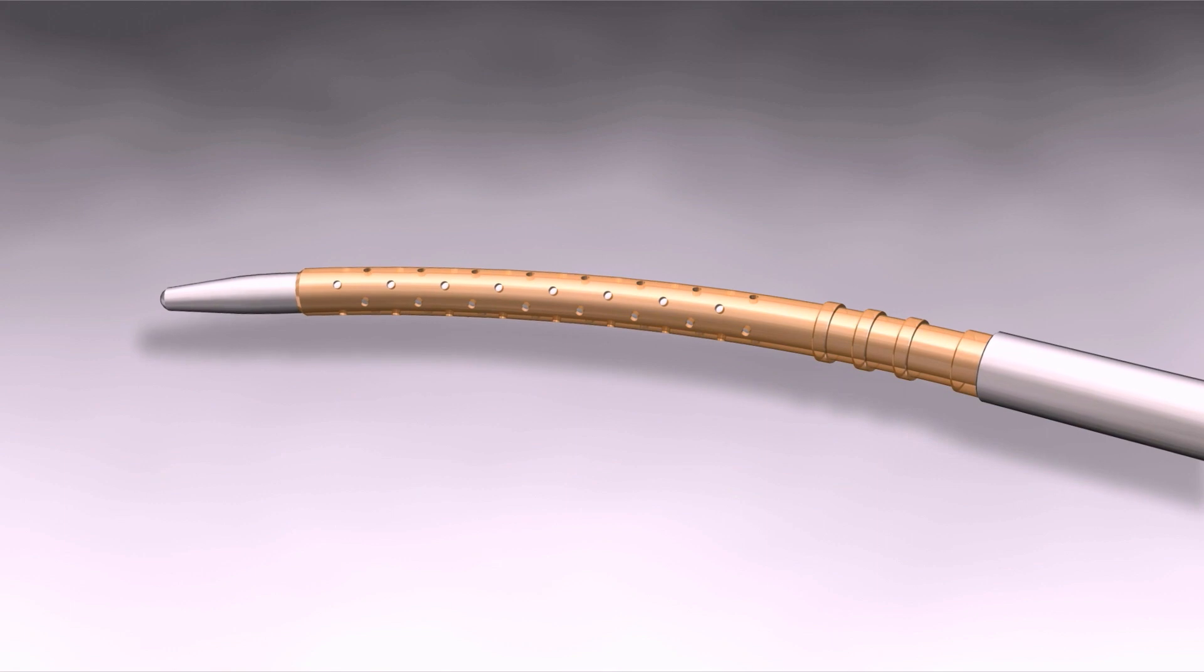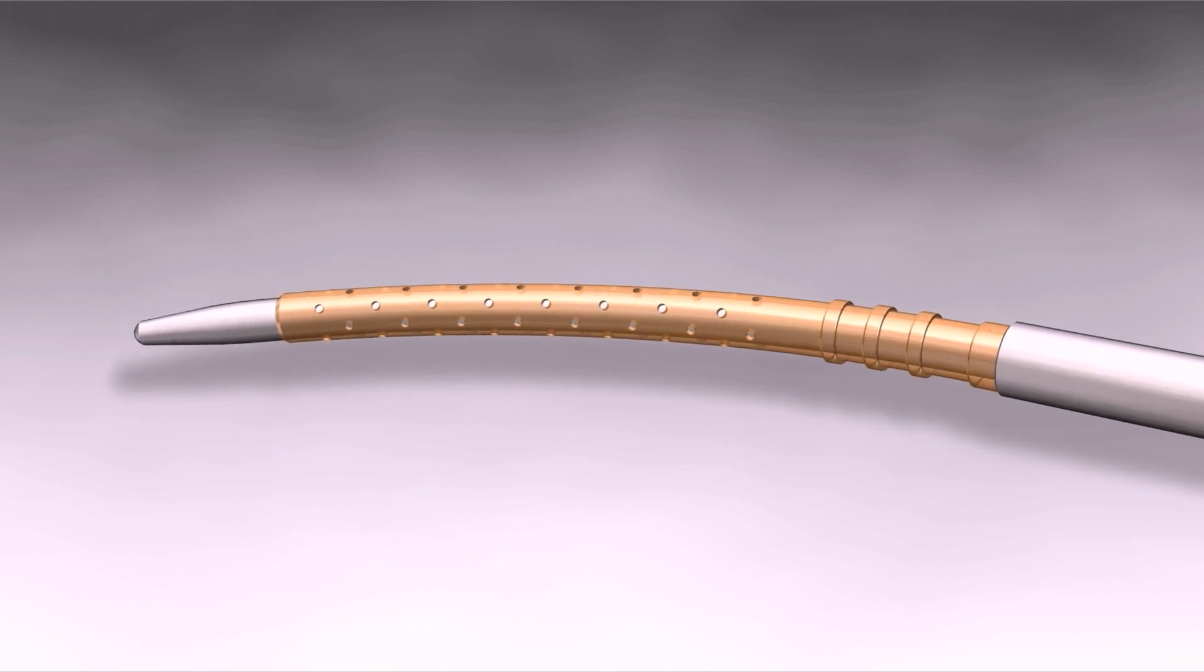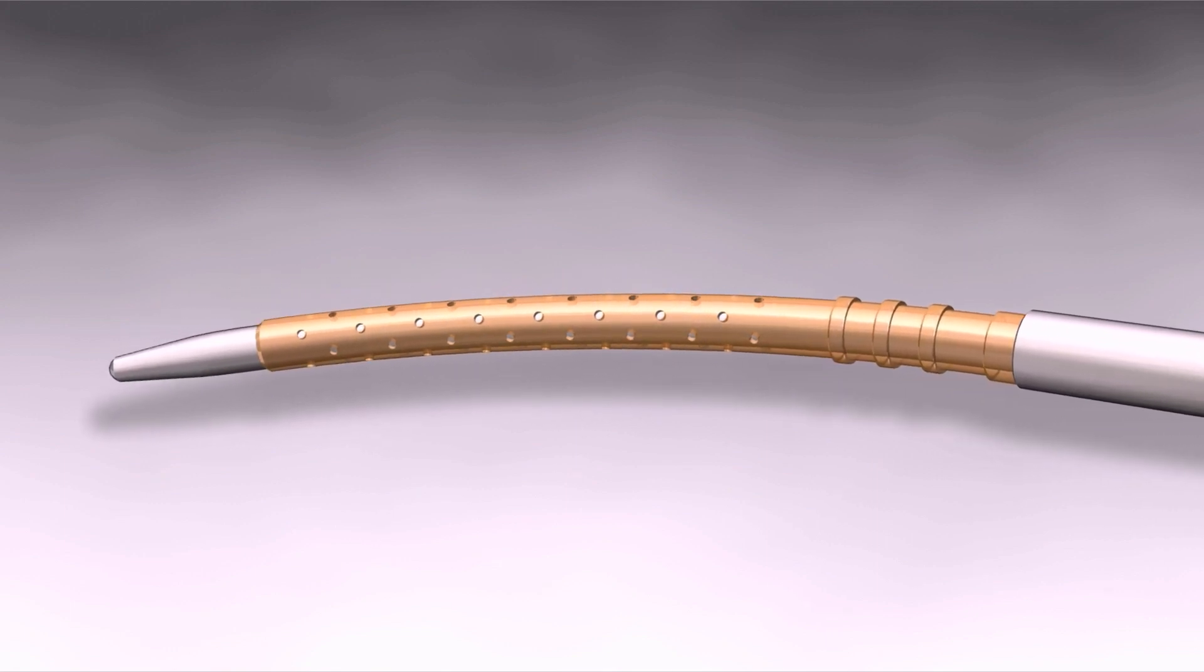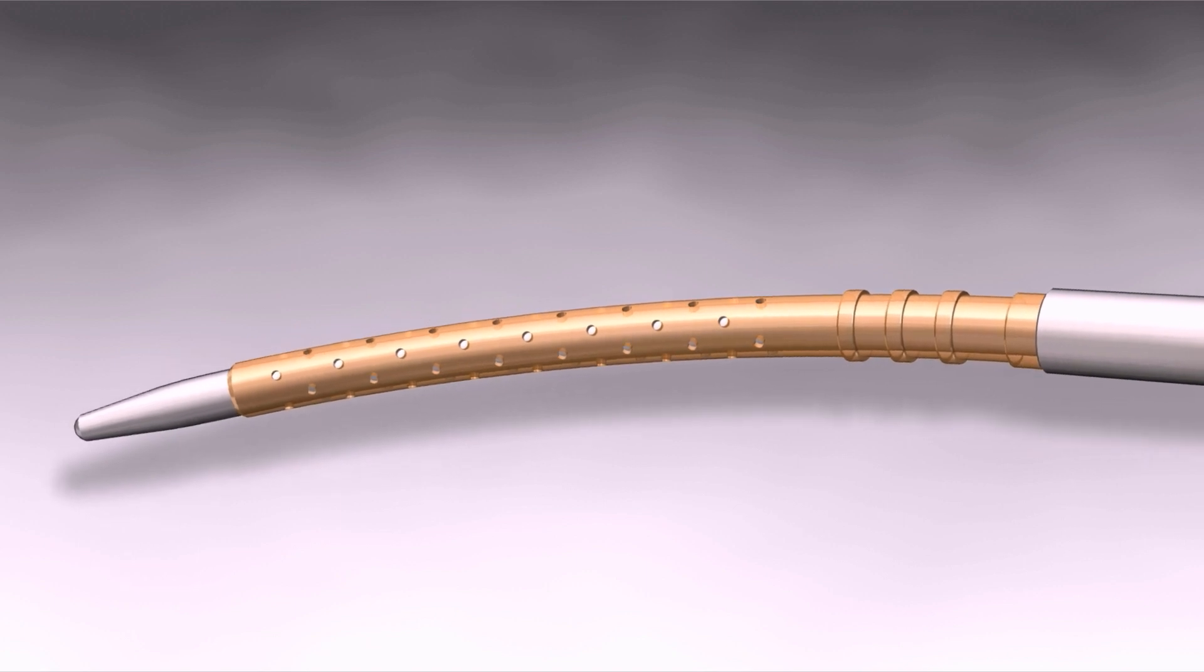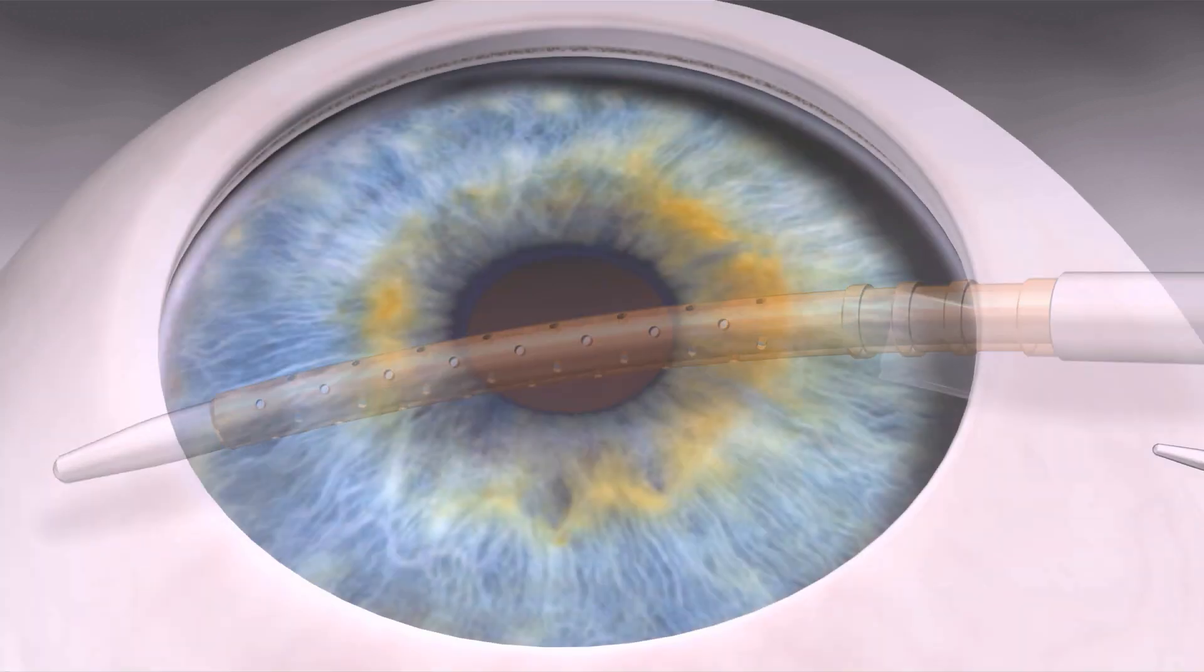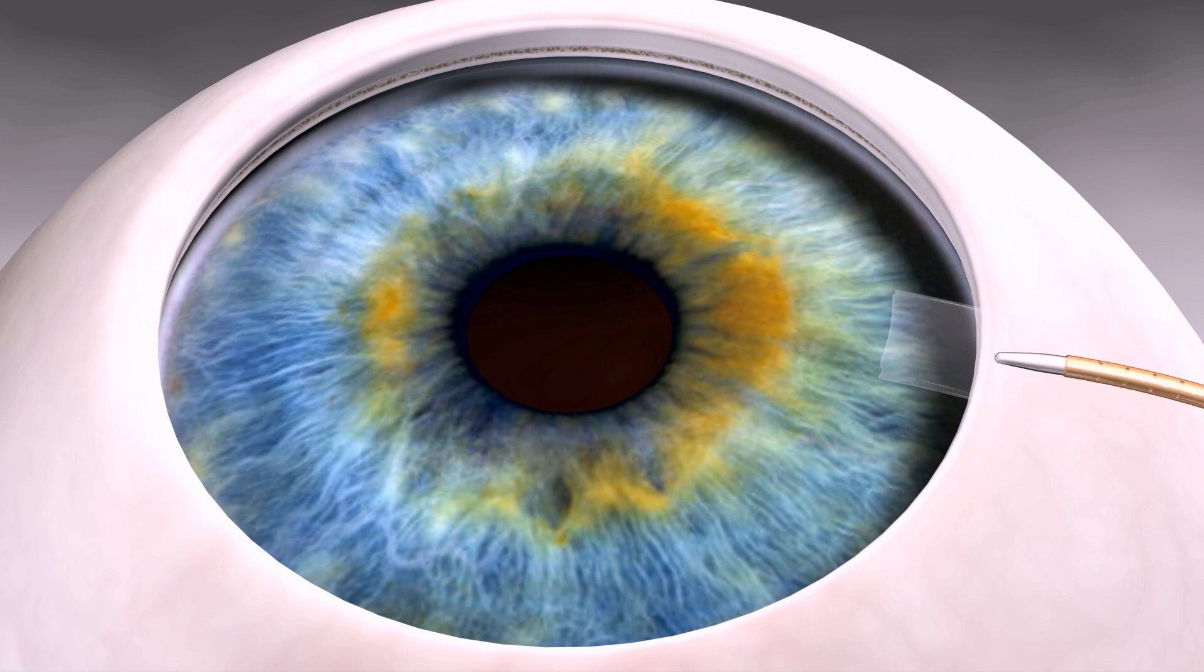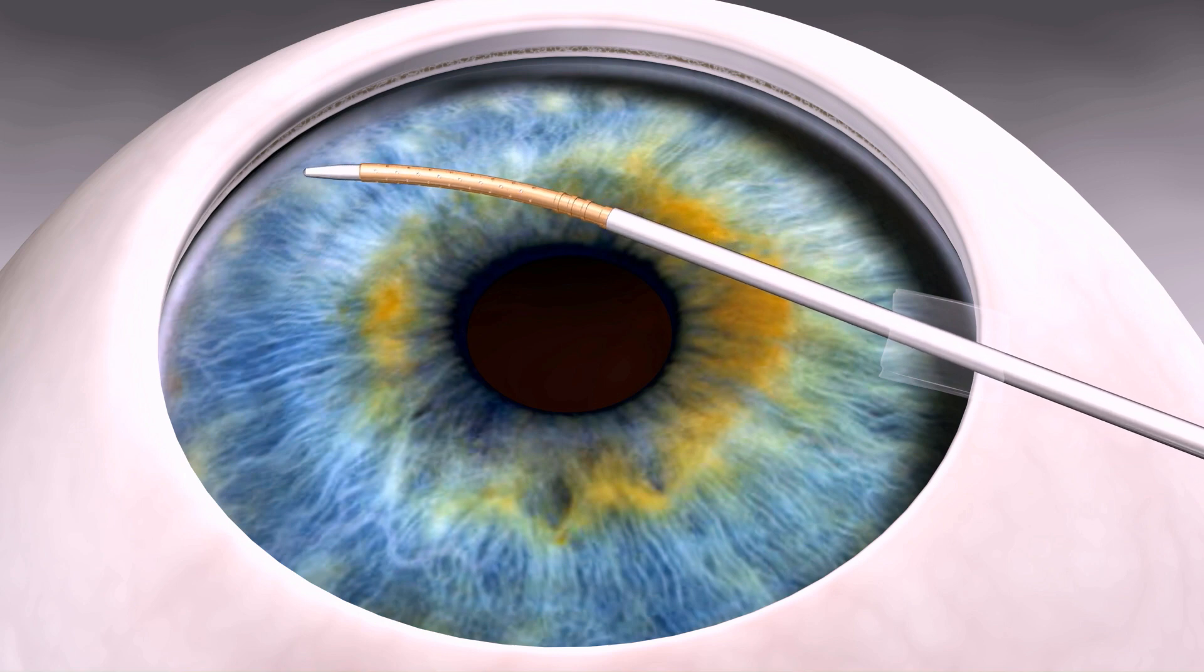The Cypass Microstent is loaded onto the guide wire of the Cypass Applier, a proprietary handheld instrument designed to facilitate the implantation procedure. The Cypass Applier is introduced through the paracentesis and guided to the implantation site across the anterior chamber using magnified visualization.